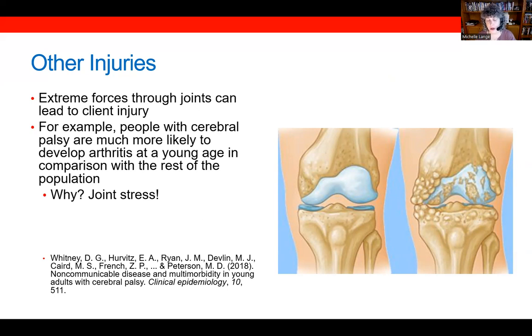And when that person is in a static seating system and cannot move their joints, but there's still force occurring within the body due to extension, that force has to go somewhere. And that force will end up going to the point of least resistance, which is the joints. If we can relieve some of that force through dynamic seating rather than let it build up in the joints, we can conceivably prevent or minimize some of this joint stress and even arthritis.